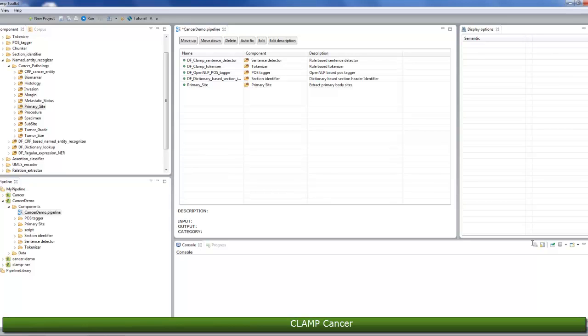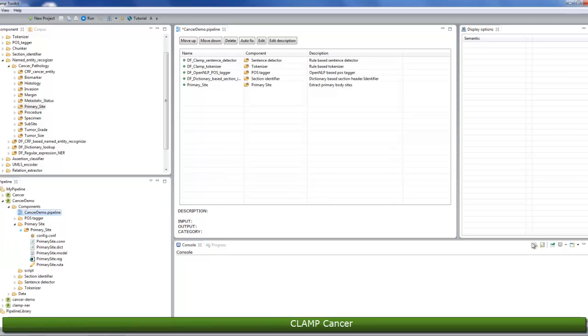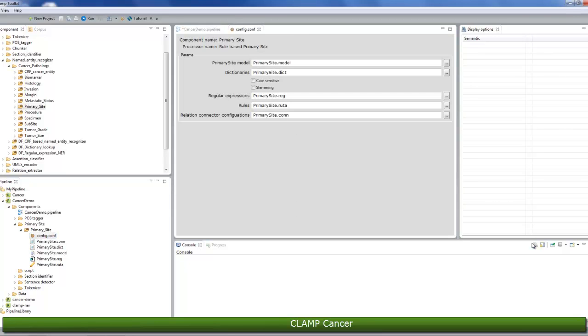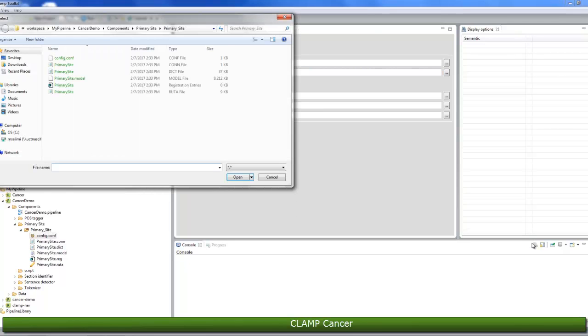First, you can either accept the default parameters for the components, or you can modify the parameters based on your needs. To do this, simply double-click the config.conf file to open it in the middle window and modify the parameters that you're interested in. For example, you can replace the default dictionary file with your own dictionary file by clicking on the three dots button and selecting your own file.